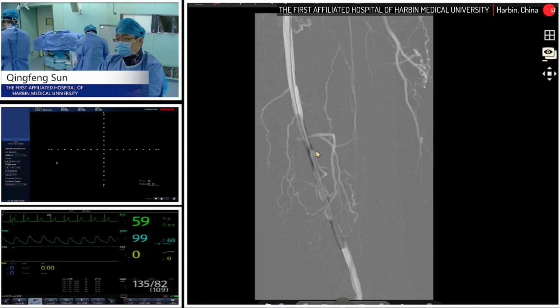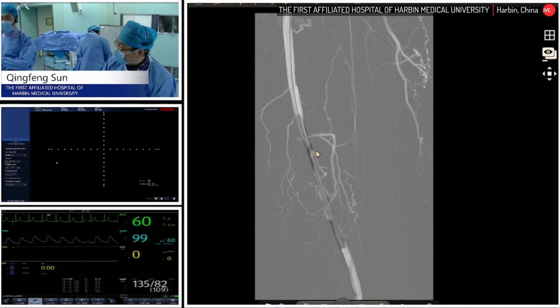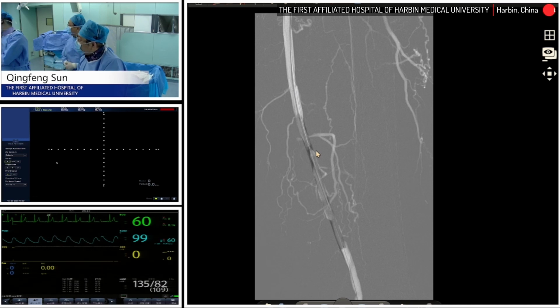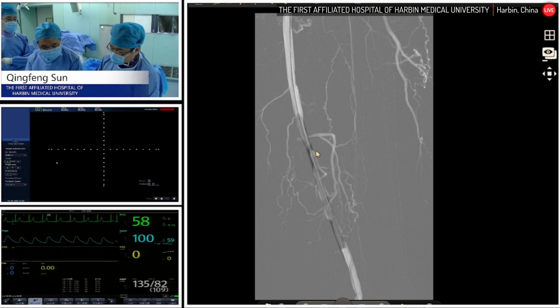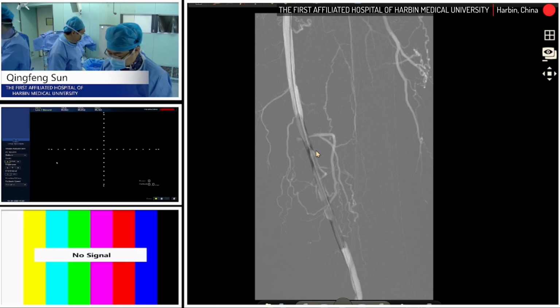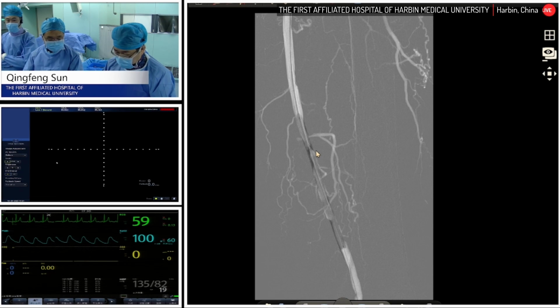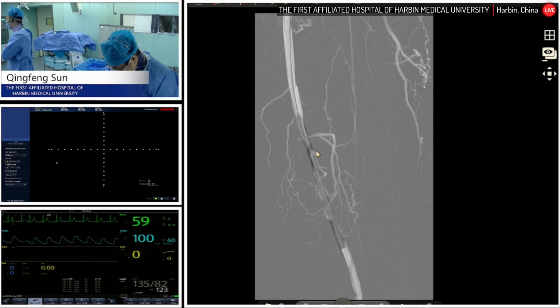So in this case, we prefer the old school way, right? The old school way would be much better. And we have another question. Except for the use of IVUS, any other tools you want to use for this case? I think if we have a perfect vessel preparation, the next one is DCB, right? Yes, DCB, and leave nothing behind, which is quite popular right now. So we do the intervention, but we leave nothing behind. Of course. More precisely, we won't leave the wrong thing behind, not nothing behind. You're right.